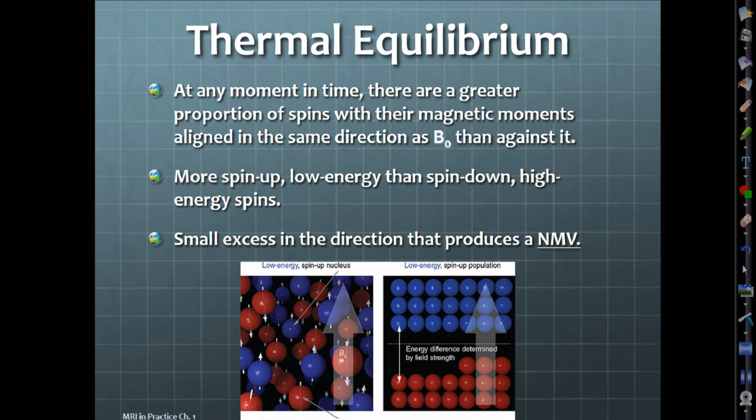Which is always, right? There's always going to be more, because it takes more energy to oppose than to simply go with it. So there's always going to be an abundance of low energy. That's why we see here there's a deficit of the high energy by 4.